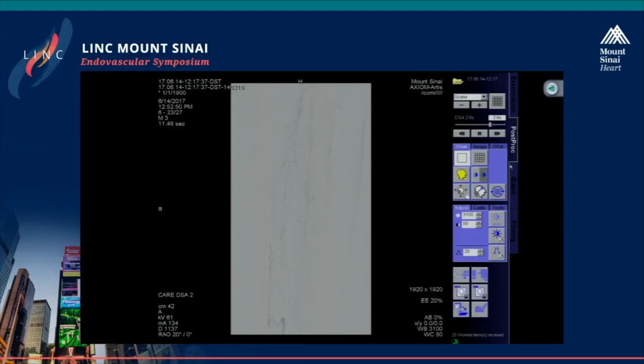What I'd say about that is we don't bypass to multiple vessels when we do a bypass. We only bypass to one, but we're getting a different level of perfusion when we bring a saphenous vein down to a tibial target. So I tend to judge how dramatic my change was from pre-op to post-op after that one vessel. Typically I would try from above to get a couple of vessels open, but I would definitely reserve the pedal loop maneuvers till I see that this wound isn't healing. One of the problems is how the foot looks, how advanced the disease is. At that stage you can decide, this is my last option, I have to do everything in one stage, or I can postpone and see how it's going.